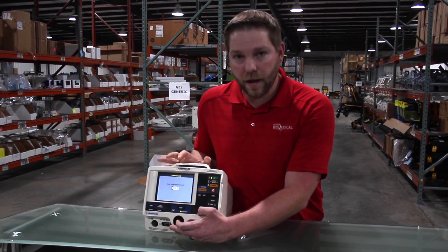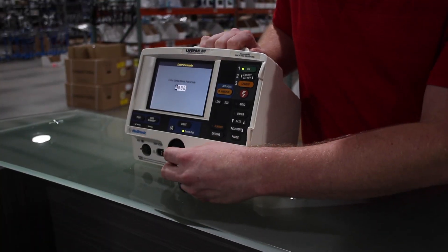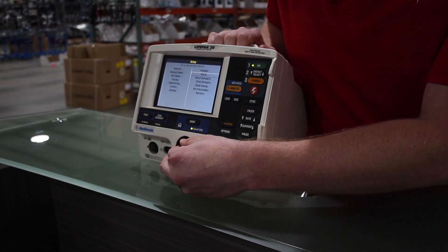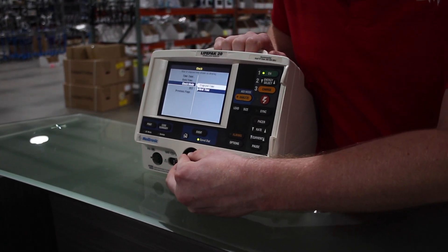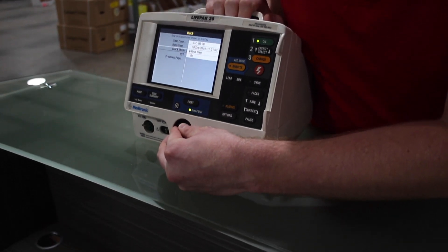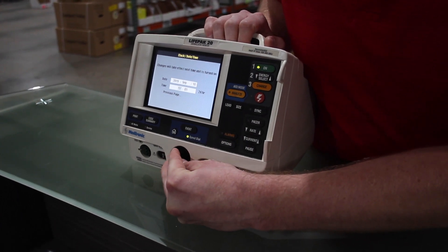I've set all passwords to zero for today's demonstration, but your facility may have a different password. This takes you into your first service mode. First thing I recommend is go down to your clock and verify that your time and date are correct, in case any issues come up in the future. It also gives you an accurate record of when your last PM was completed.